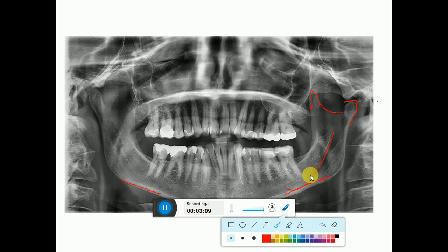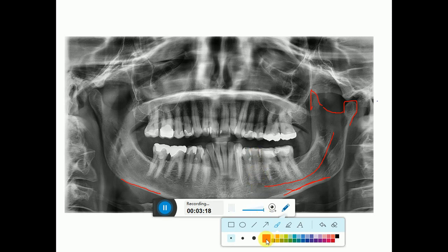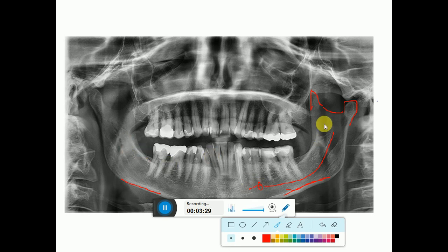This is the inferior alveolar nerve canal, running up to here, and this is the mental foramen, which is present at the apex of the second premolar. From here the mental nerve will come out. That covers the mandible structures.